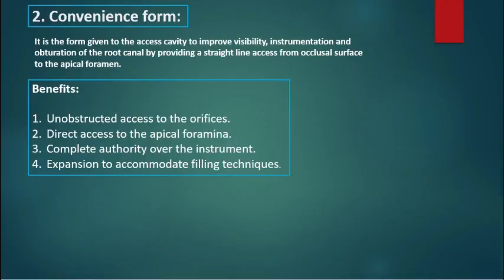Now, the second principle is the convenience form. The convenience form makes for more convenient and accurate preparation and filling of the root canal. 4 important benefits are gained through the convenience form modification. First of all, better visibility by having unobstructed access to the canal orifice.